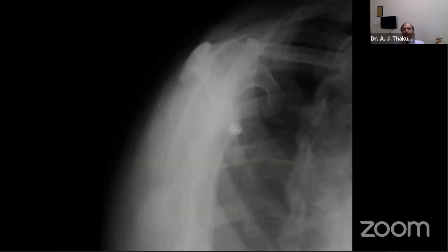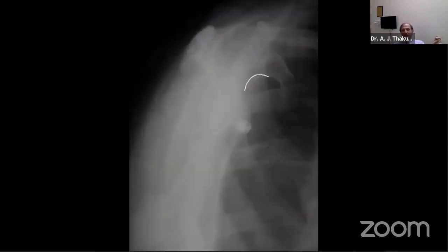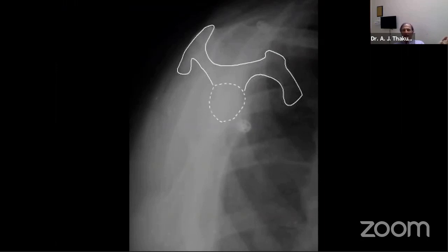So if we trace the lines, then we have something like this, which is the coracoid process anteriorly, and then we continue tracing that line, and then we have the acromion. So we have something there. After that, we try and locate where is the glenoid. Here it is, and then the body. So once you know what silhouette to follow, it is so easy to find out where is what.